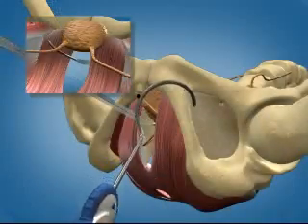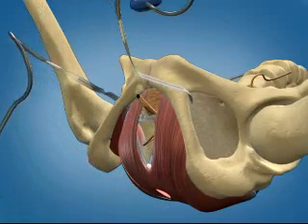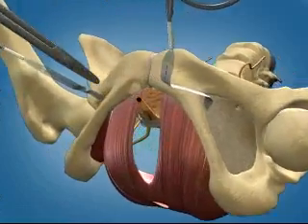Connect the mesh to the needle and retract through the same needle path. Cut away the needle and connector and repeat this sequence on the patient's right side.